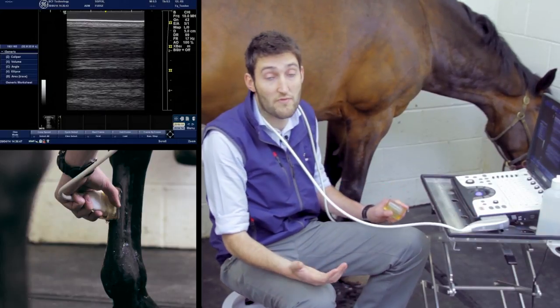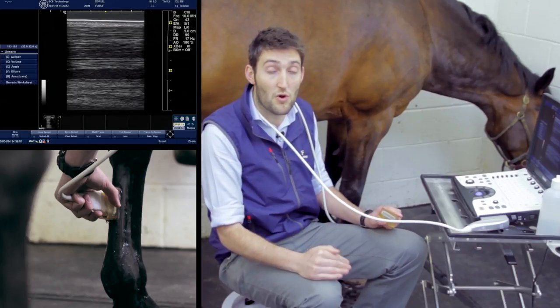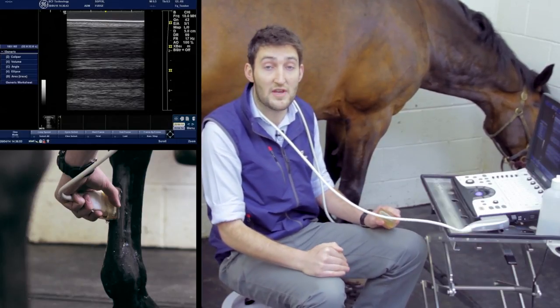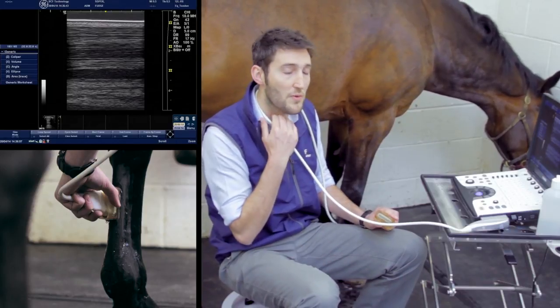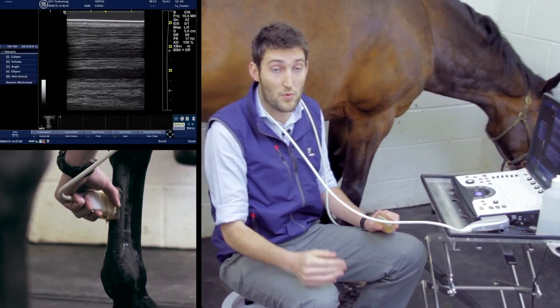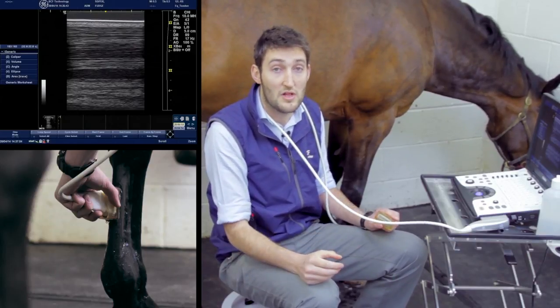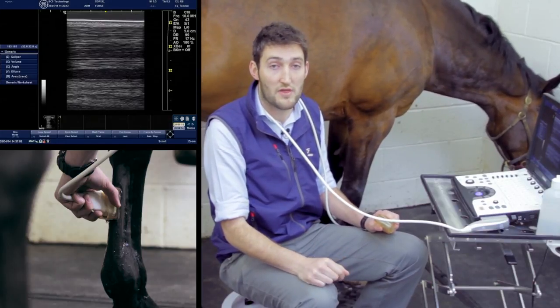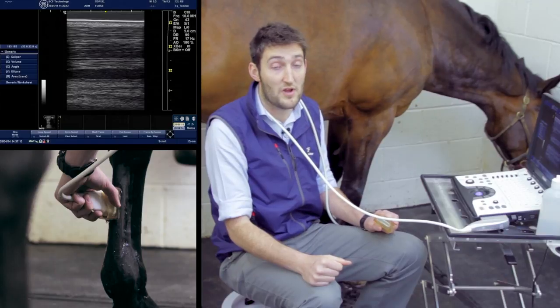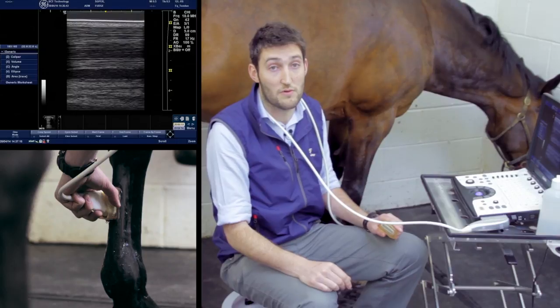Once happy with that region, work your way down the leg through zones 1a, 1b, and so on, all the way down to 3c, to cover the full length of the leg. Particularly lower in the leg, assess each individual structure rather than just looking at the whole picture. Sometimes that means optimizing the image for one structure, freezing and saving, then moving the probe slightly, optimizing for another structure, and saving again.